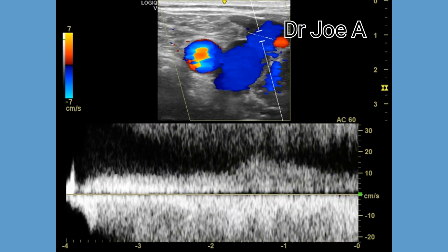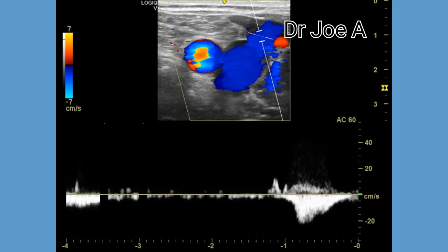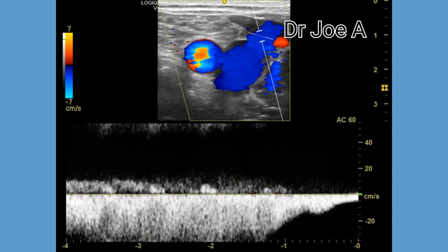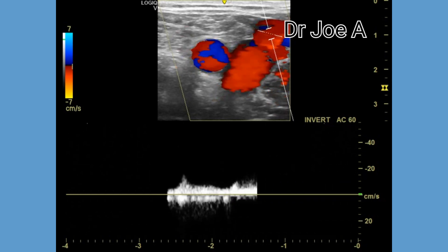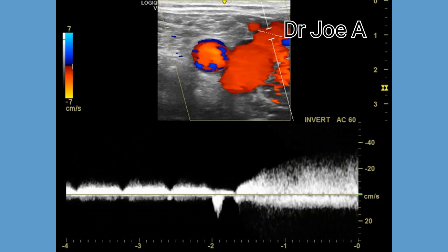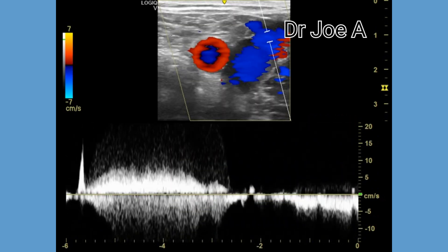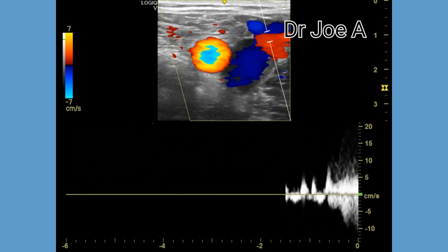When the duration of reverse flow in the saphenous vein and the saphenofemoral junction exceeds 3 seconds, it is considered to be a significant finding that may indicate a more severe and advanced stage of the disease. The prolonged duration of reverse flow indicates that the valve at the saphenofemoral junction is not working at all, allowing blood to flow back down the vein towards the calf for an extended period of time. In such cases, where the reverse flow lasts more than 3 seconds, the high pressure caused by the refluxing blood can lead to increased dilation and tortuosity of the saphenous vein and the tributary veins, resulting in the formation of varicose veins in the calf.